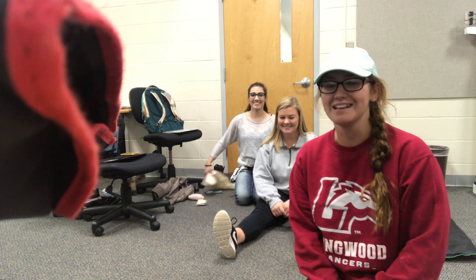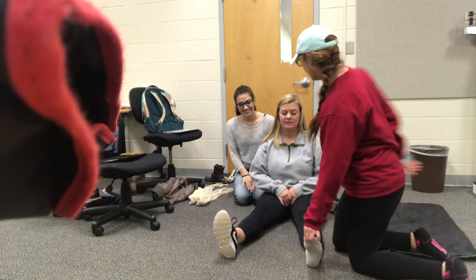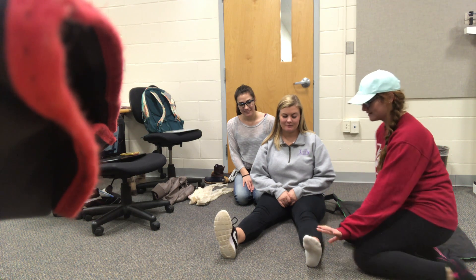Hello, this is a splinting demo for joint immobilization to a broken knee. Can you feel this? Yes. Can you wiggle your toes? Yes. It's a CMS, it's good.